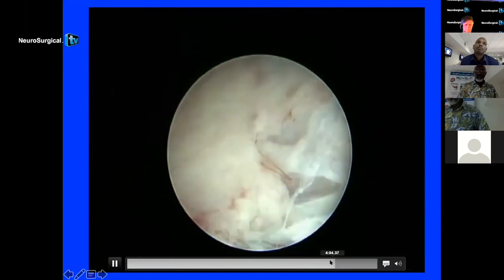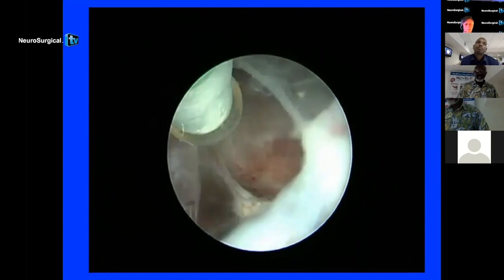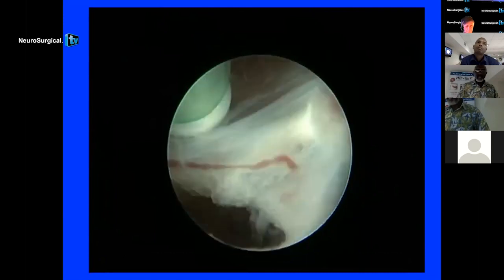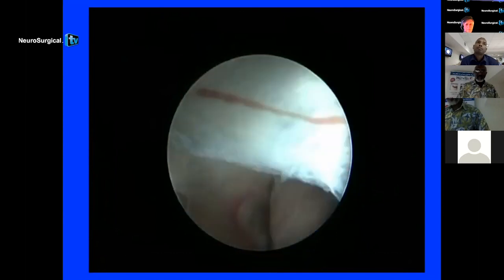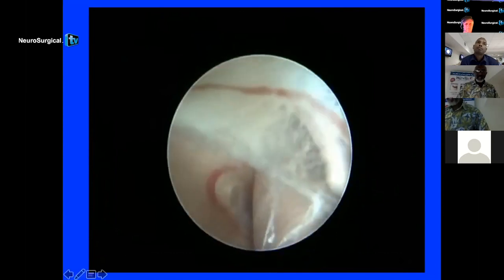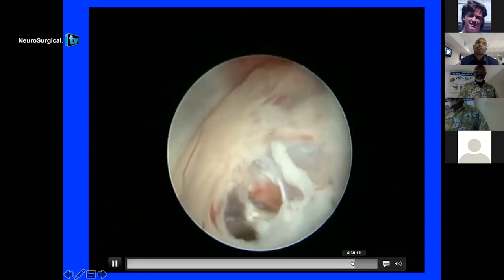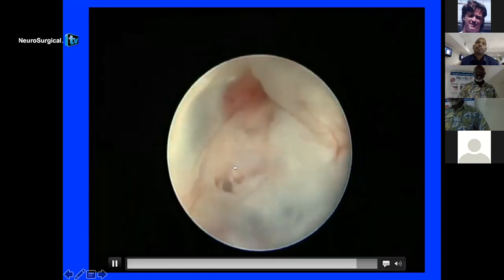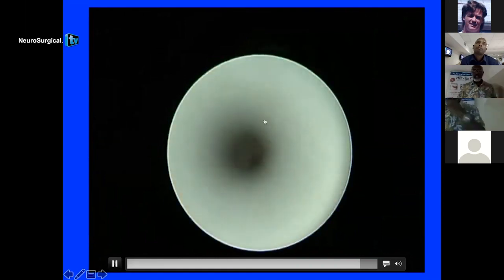the scope right through. There are bits of the membrane still there, liliequist membrane, but we are able to see the basilar artery right there. That's an example using the tube. We don't widen that anymore, but I think purists would say that's a sheath that we use for the endoscope.